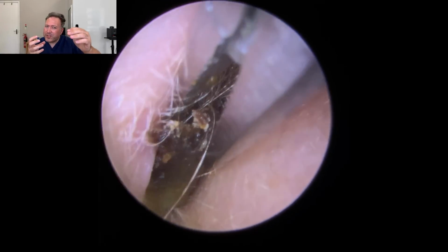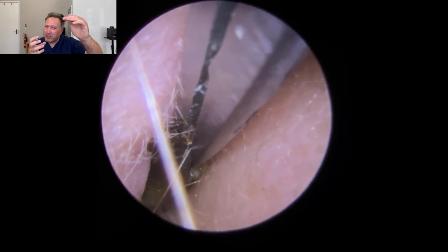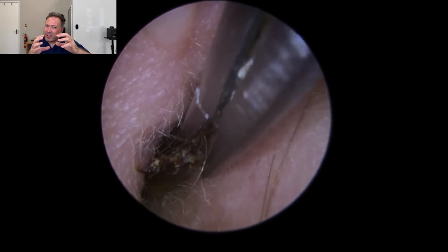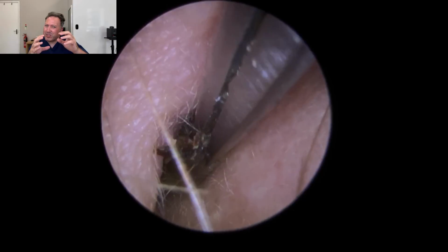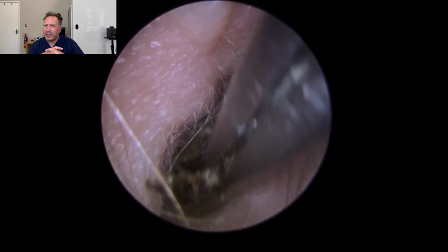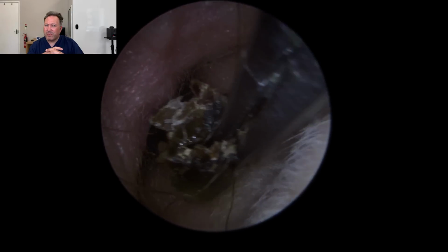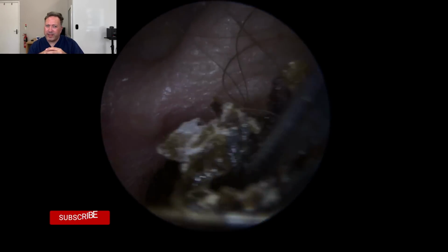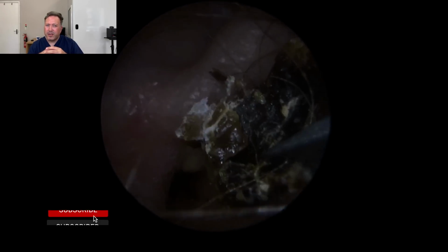Look at the color difference in the waxes coming out there. Where the forceps are at the top is really dark, a much lighter material. That shows me that it's that kind of wetter, more sludgy sort of liquid wax behind. So there's got to be something going on behind this. There we are. That's all coming away. So that whole section came out in one. You can see the color difference a little bit more clearly there as we kind of focus in on it.